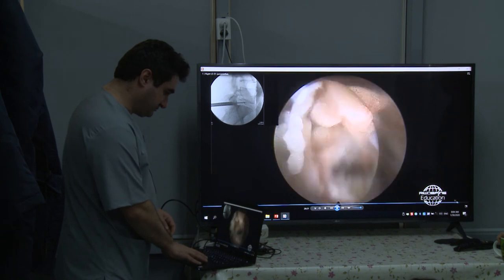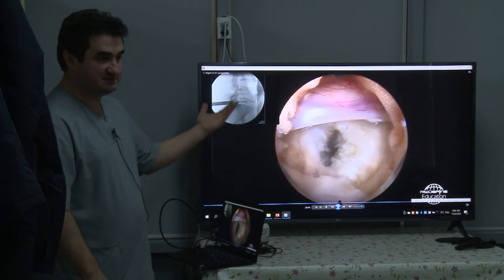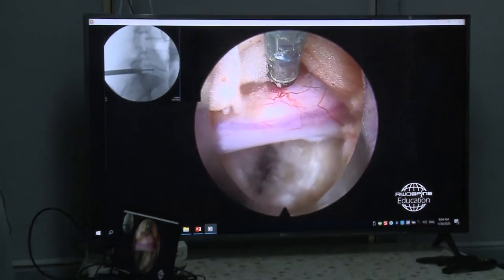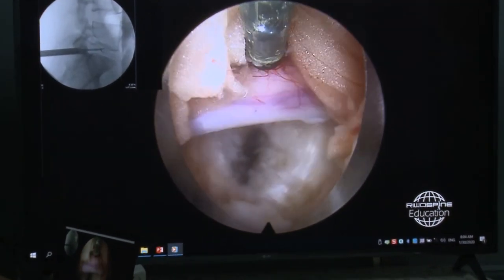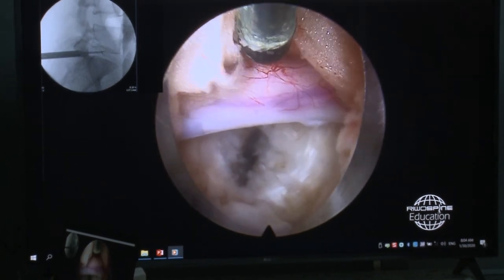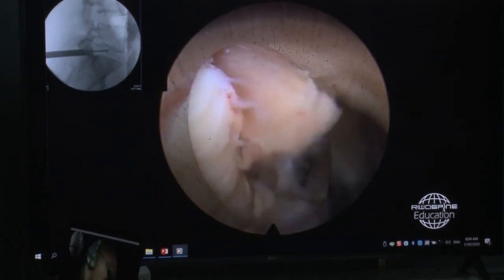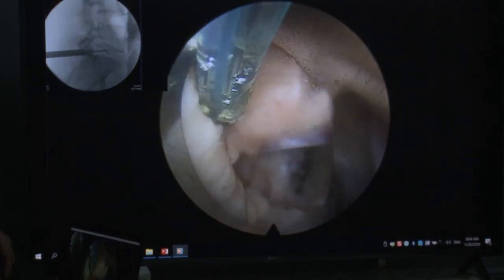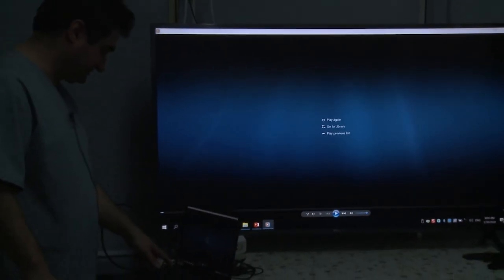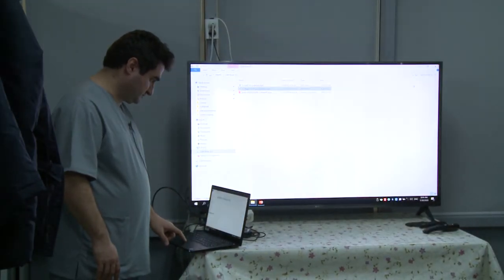Yeah. Maybe these are the questions? Yeah, this is the final position. Almost the same, you see. In my opinion, we can finish here, yeah? Are there any burning questions? Floating of PLL? There's no PLL here, yeah. You see the floating of the structures. PLL is not.